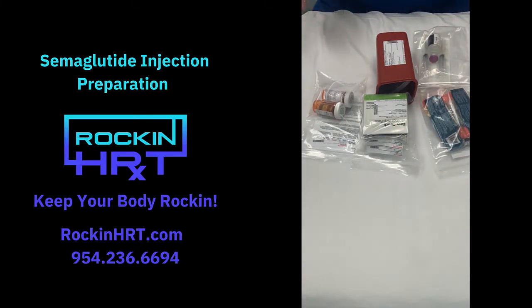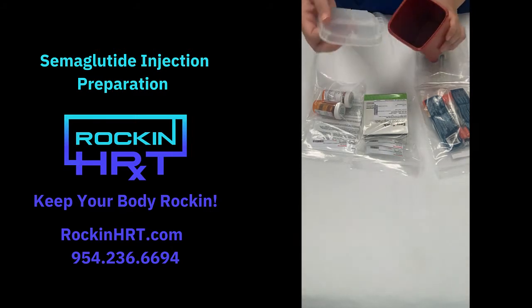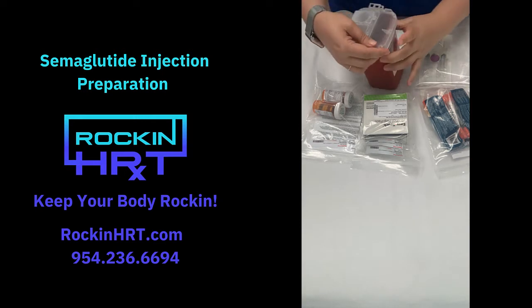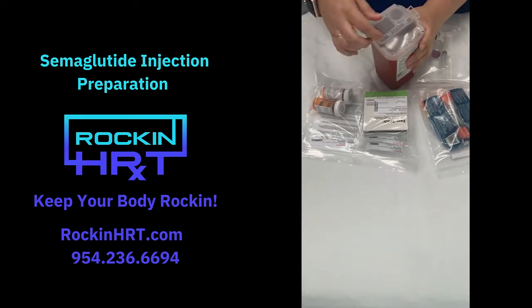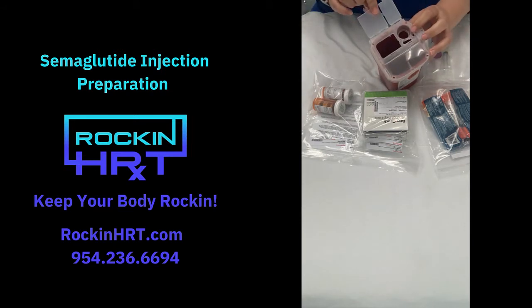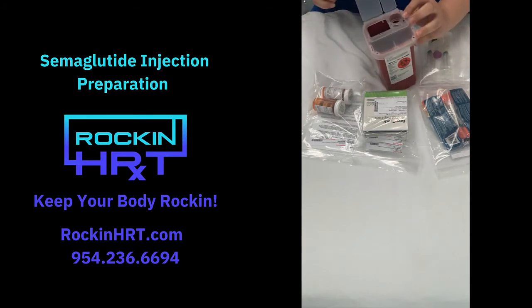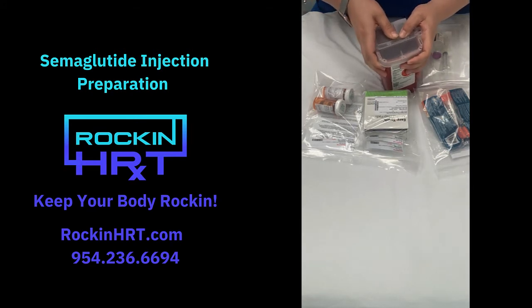When you get your package in the mail, this is what it's going to look like the first time. You're going to have a sharps container. You'll take the top out and just snap that right on top — it's a little hard. You can open and close these when you want to dispose of your sharps. You can also unscrew the needle from the syringe, put the needle in the sharps container, and discard the syringe in a regular trash can, which I will show you later.